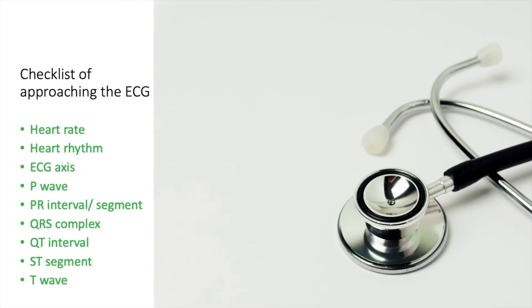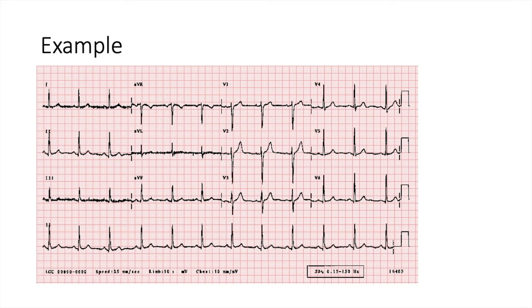That's everything we needed to cover in order to systematically approach an ECG. Let's look at an example bringing everything together. I would start by confirming the patient details, when it was taken, and then look at the calibration — that looks like about 10 squares, so that's completely fine. Looking at the speed of the paper: it's 25 millimeters per second, which is completely normal.